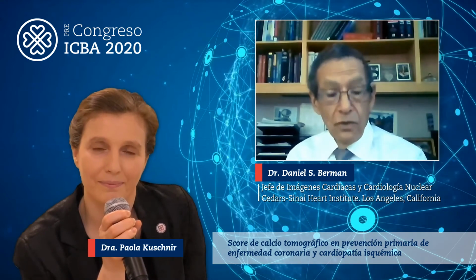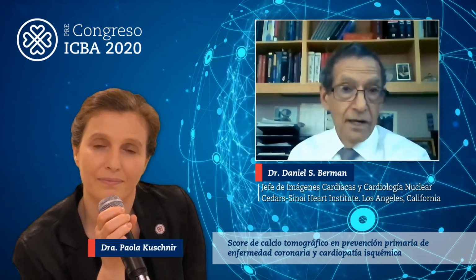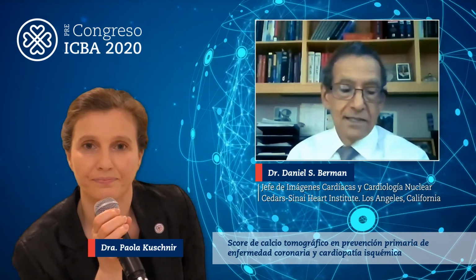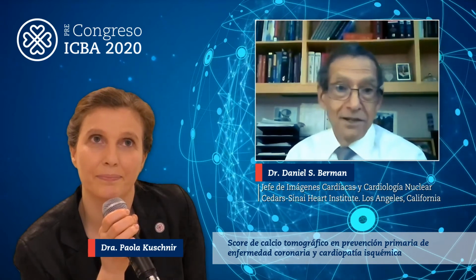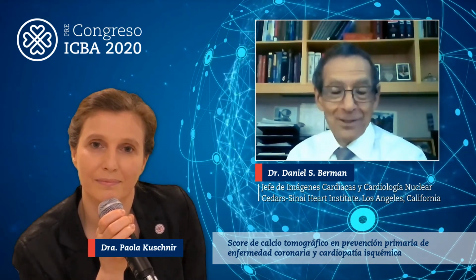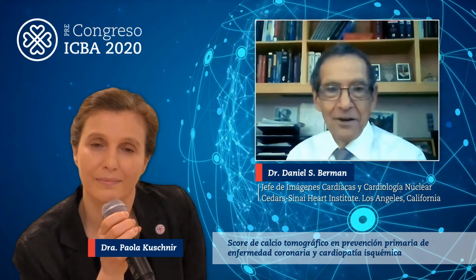We do, though, consider ischemia testing, particularly in sites where we don't have coronary CT angiography that is of such high technical quality and where the expertise might not be present, in which case we believe that stress imaging is better. And then finally, nobody's tested how the treadmill test fares compared to the other studies. So it's conceivable that even a treadmill test could be used in the patients with the higher calcium scores.